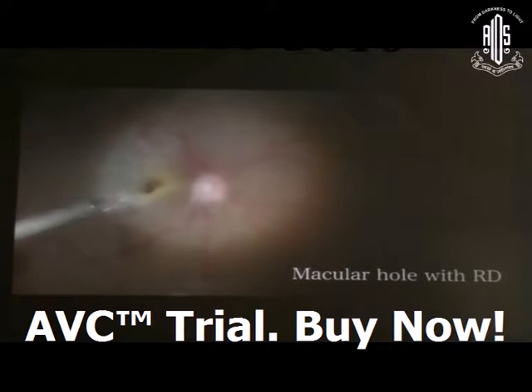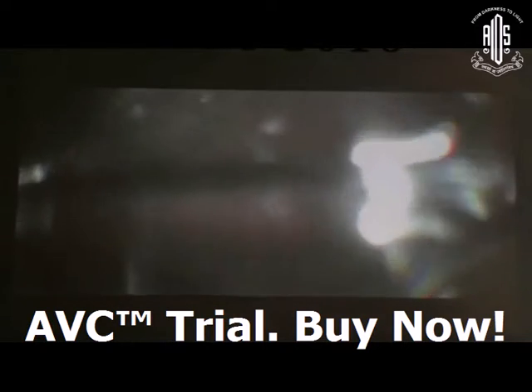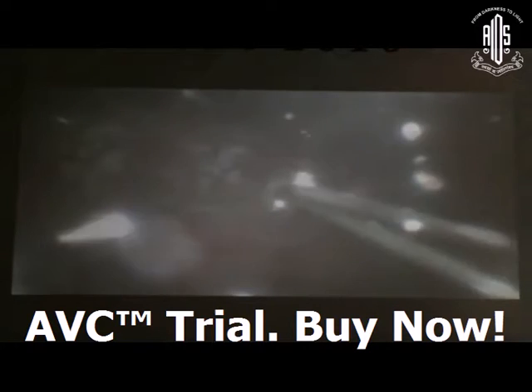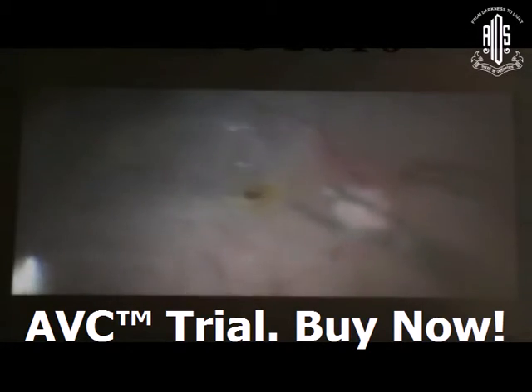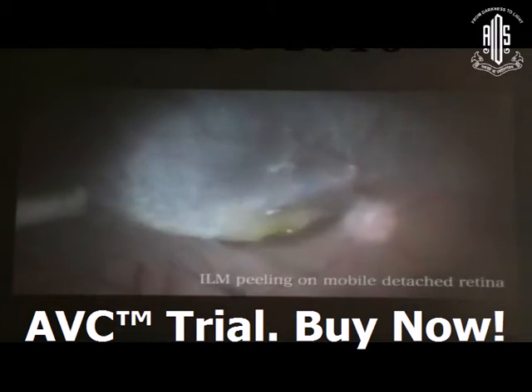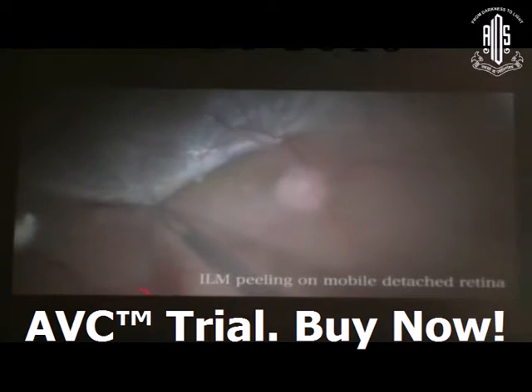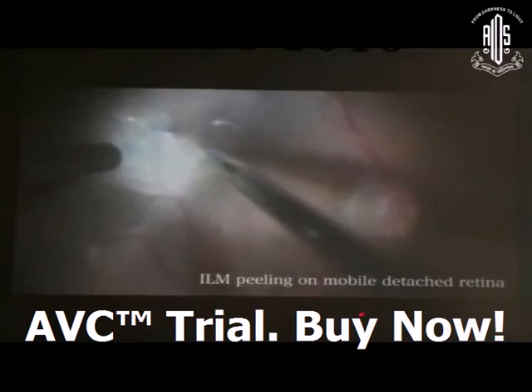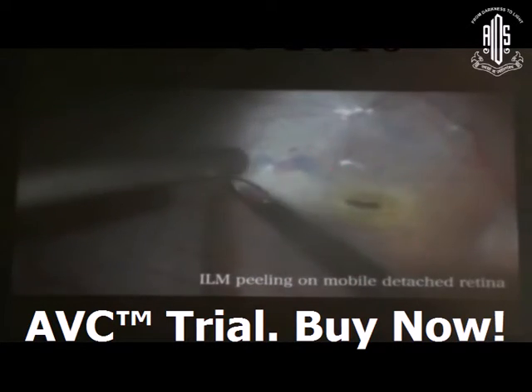Another situation is macular hole retinal detachment — sometimes arising without any preoperative notice, and sometimes associated with peripheral breaks. You have to stain the internal limiting membrane with brilliant blue G dye under air, or you can inject the BBG dye in saline. ILM peeling can be done on the mobile detached retina or under PFCL.